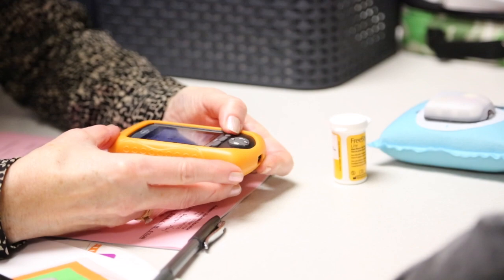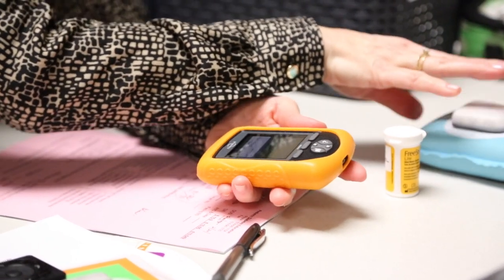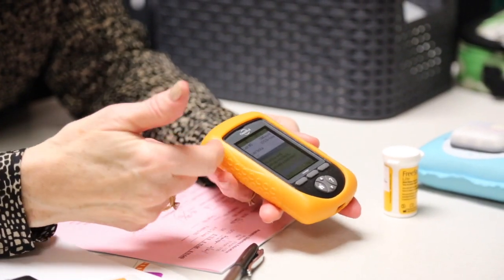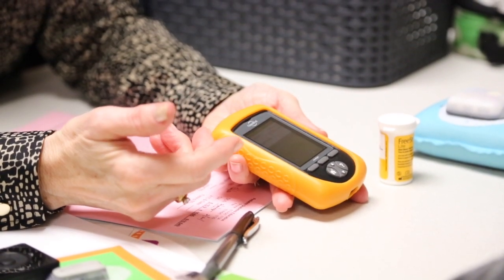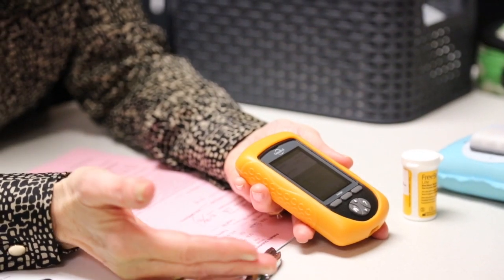Yeah. Enter and confirm. Now, it knows it doesn't have a pod, so it didn't actually give that, but it did do the math. And it wasn't your math because it's not programmed for you, Andrew. Sure, sure. But being able to precisely give the dose can be so helpful.